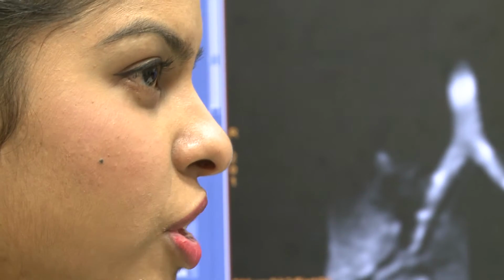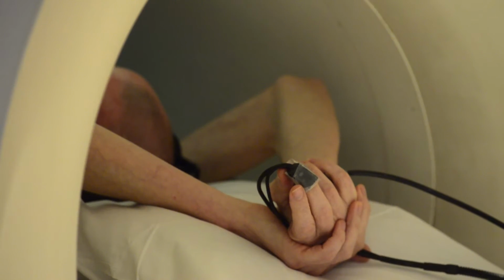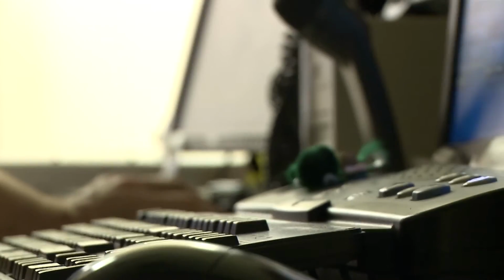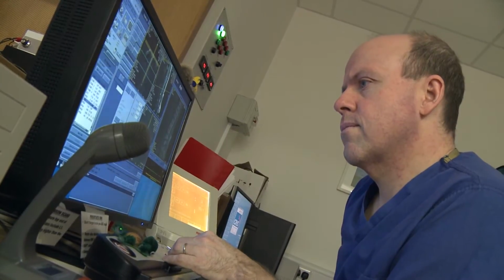So when you do a normal MRI, the lungs will just appear black, and that's because they're full of air, and air doesn't give us any signal or tell us what's going on. So the xenon gas acts as a medium for us to look at the lungs. The Xenon MRI picks up a signal from xenon itself, whereas a normal MRI picks it up from hydrogen protons in the body, which are mainly found attached to water, as in H2O.